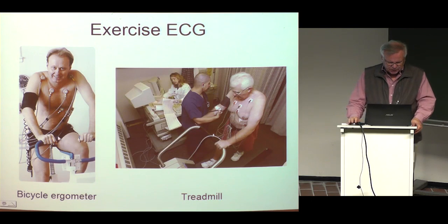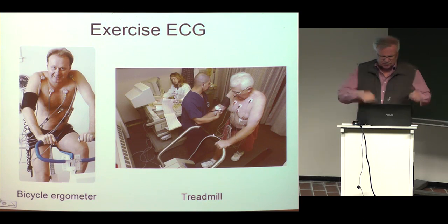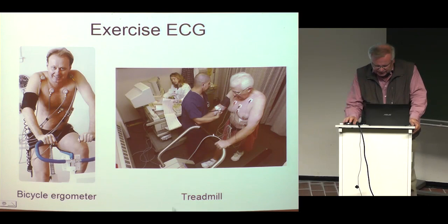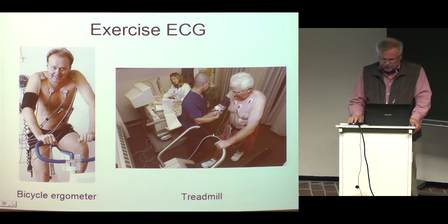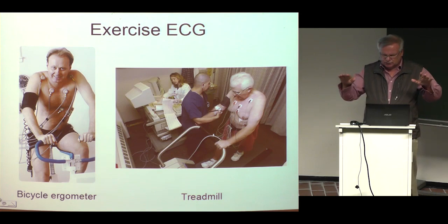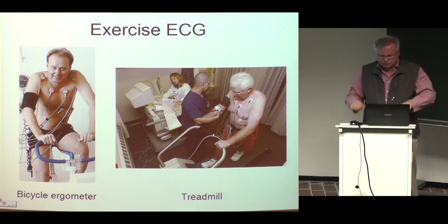One is the bicycle ergometer, which is a kind of bicycle, a bike. There is some resistance in the pedals, and that gives the exercise. And the other one is the treadmill. There is a belt which is moving, and the patient is walking on the belt, and the level of the belt is raised slowly, so that it is harder to walk there.